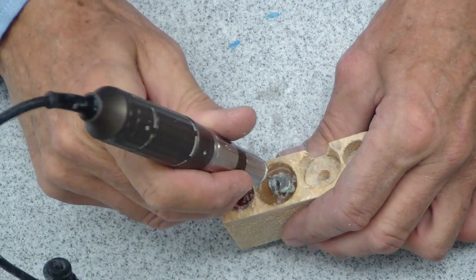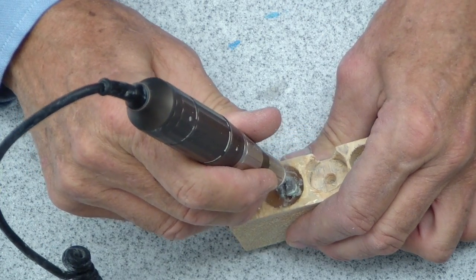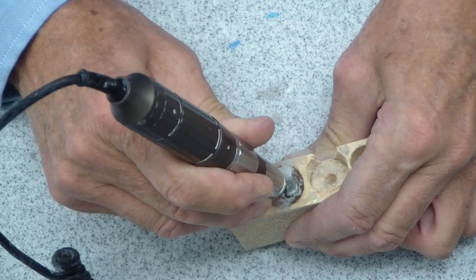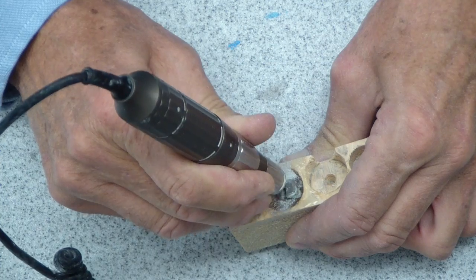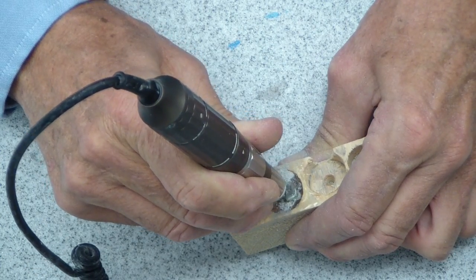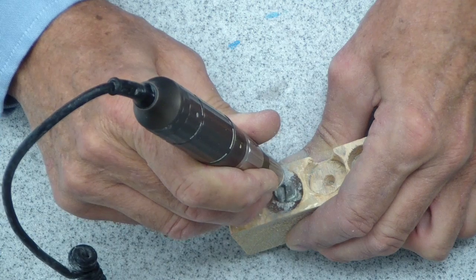A good oral surgery practice should have contra angles, impact handpieces. A lot of the oral surgeons don't like them, but for a general dentist, you're trying to preserve bone and get in different tight areas like that. I really like them. They're not that good on third molars or anything else there, but you can use them in a lot of situations. Impact handpieces are a good investment even if you do have a surgical handpiece.